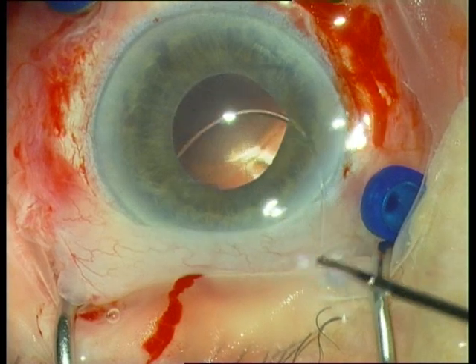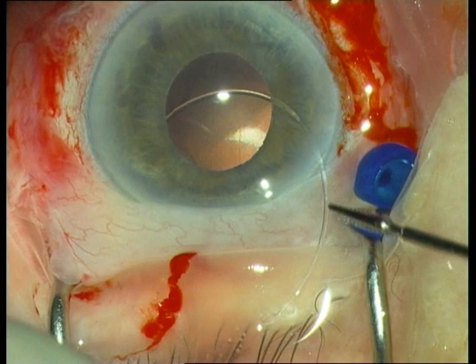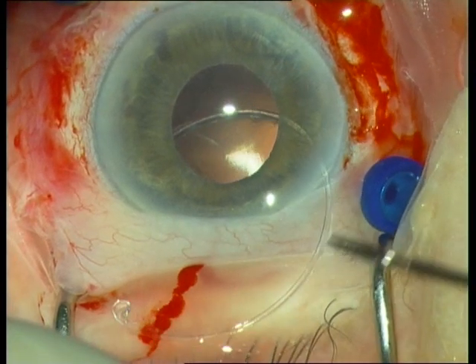Next we remove the capsular tension ring with the serrated jaw forceps from the anterior chamber.